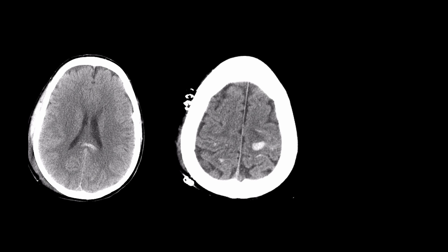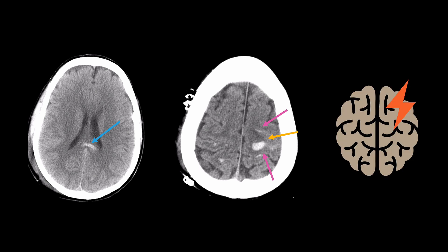CT imaging of this patient after a car accident revealed subarachnoid hemorrhage, but there was also a typical traumatic hemorrhage in the splenium of the corpus callosum and left frontal lobe, along with scattered subarachnoid hemorrhage seen in the cortical sulci. In a case like this, unless there is compelling clinical history to the contrary, the imaging is entirely consistent with subarachnoid hemorrhage secondary to trauma.